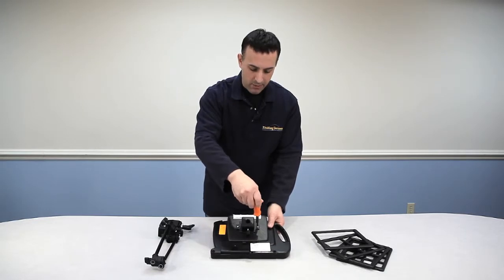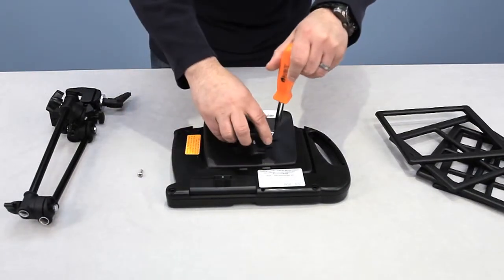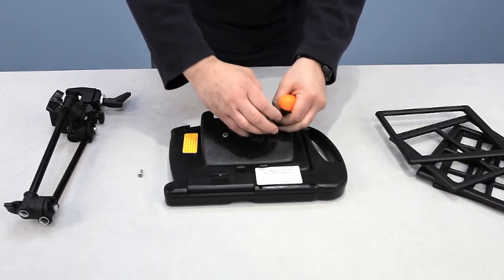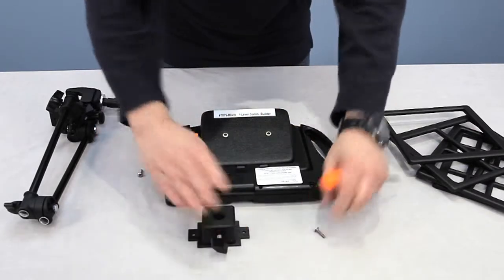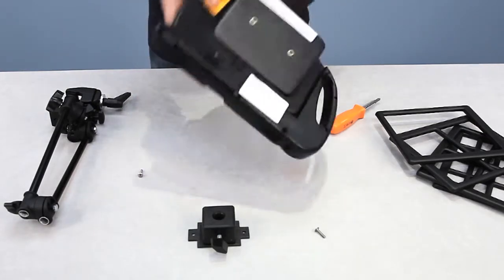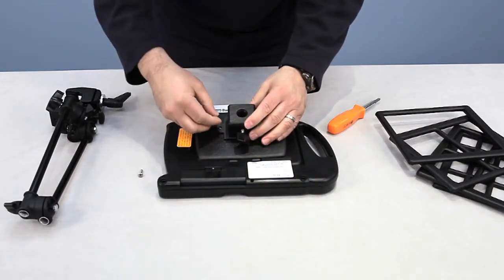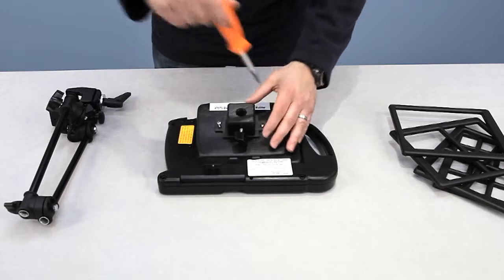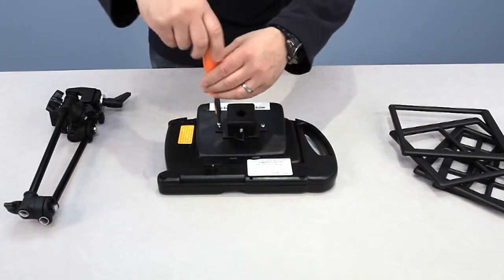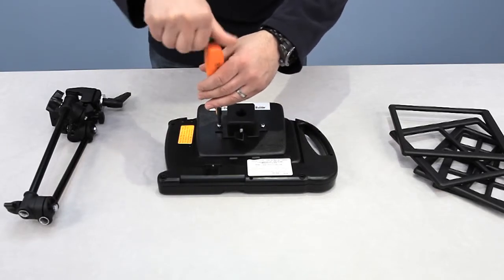This mounting bracket is removable with two screws. Take these two screws out and it comes off, making it a regular 7-Level that you can use on the tabletop. This provides a much sturdier mounting option than previous, which used to be a platform with some heavy-duty Velcro — which does work well — but this is a much more secure mounting system.